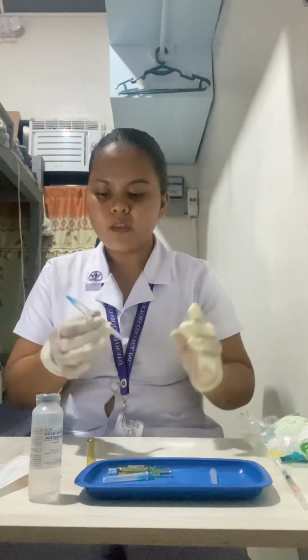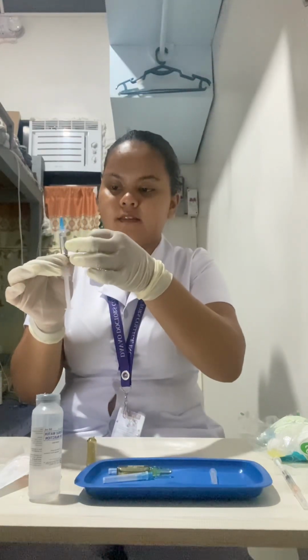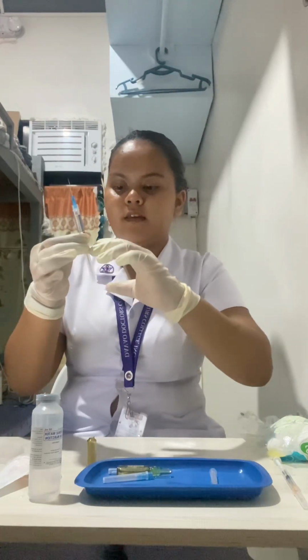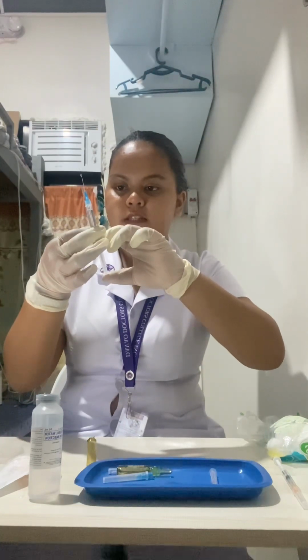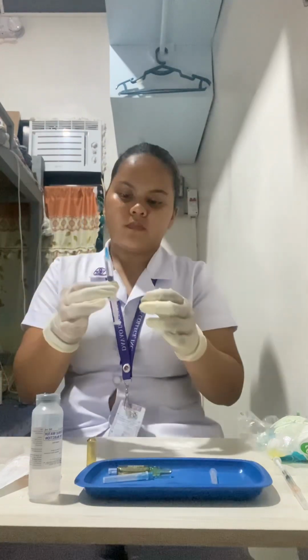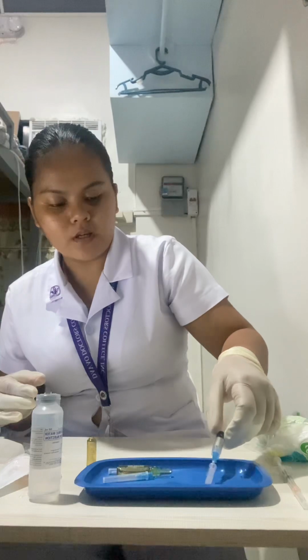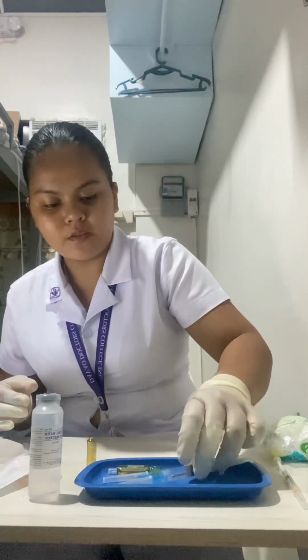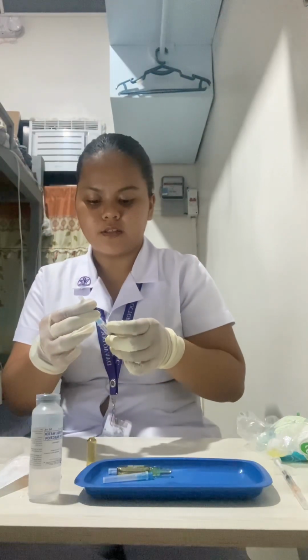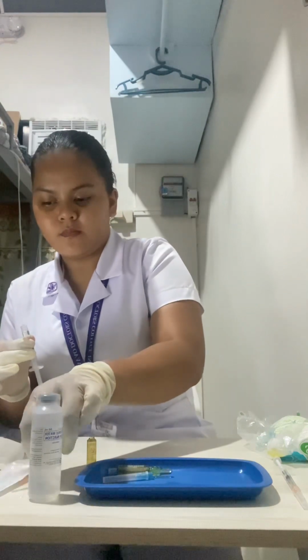So now, if there is any air present, we have to flick the syringe and then eject the air. I have no air here, so now I'm going to cover the needle using the scoop method. This is to prevent any needle-stick injury. And then remove the filter needle and dispose of it in a sharps container.